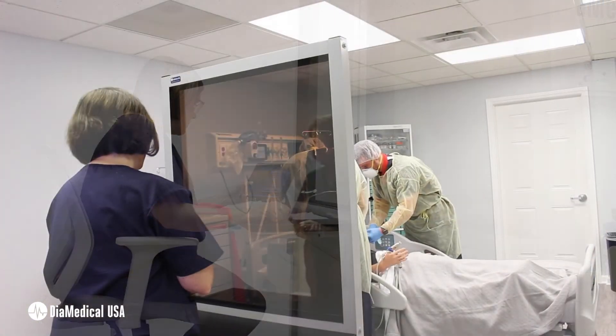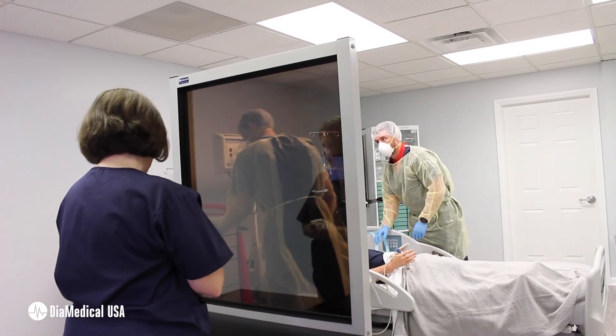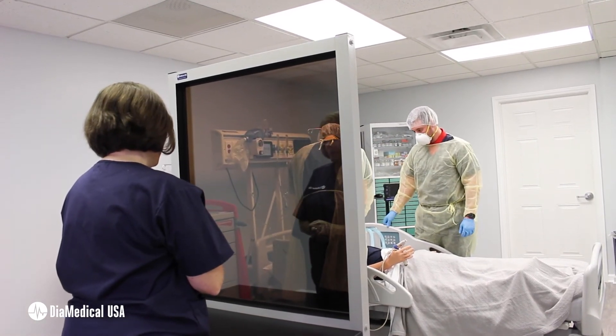Students instinctively look to the instructor to determine their best course of action, rather than using their own critical thinking skills. SimScreen allows instructors to observe students in practice while giving them the freedom to make their own decisions regarding the patient's care.